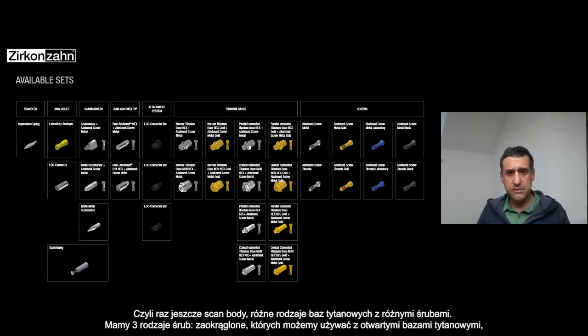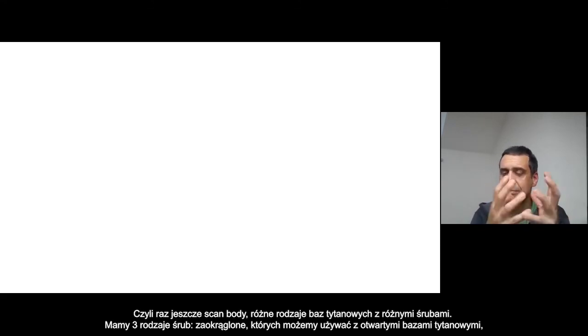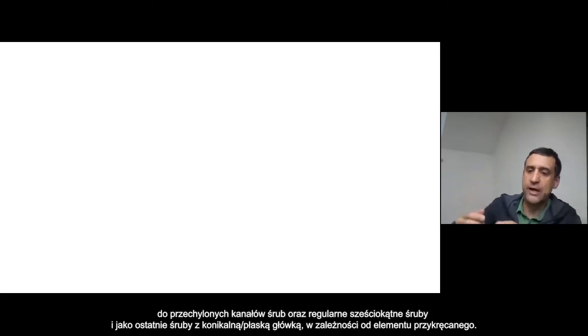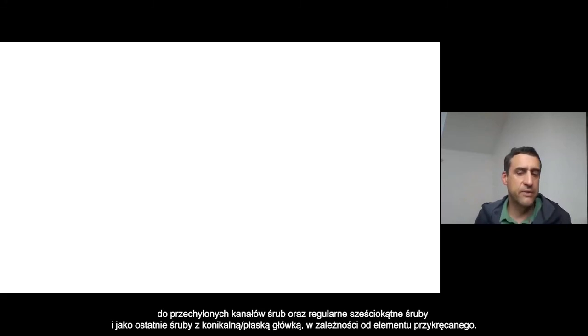The scan bodies and the different T-bases and the different screws — that's important to know about the screws. We have different screws. Basically we have three categories: the rounded one that you can use with the open T-base for inclined screw channels, then you have the regular one — the second screw.